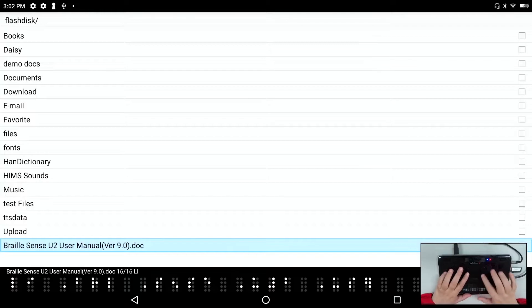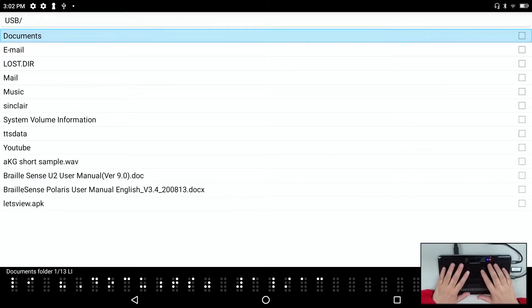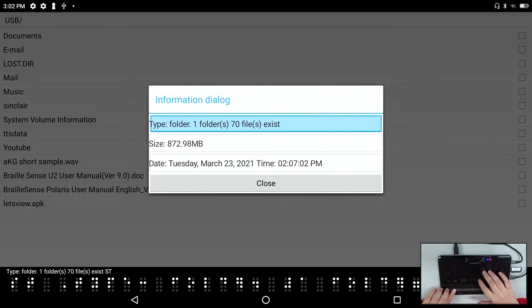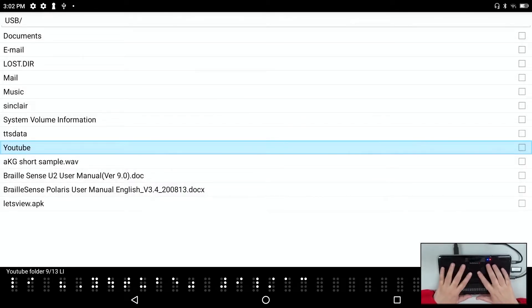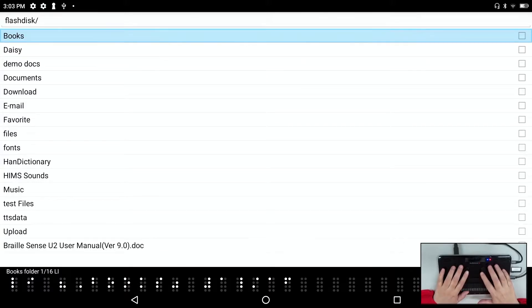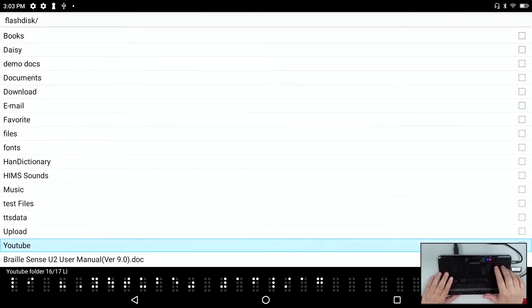Let's try copying a large folder from a USB drive. I have a folder of YouTube videos — over 872 megabytes. I pressed enter C to copy, then enter V to paste, and just like that, one object was copied. Things are much, much faster.